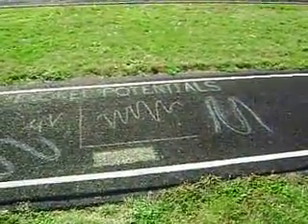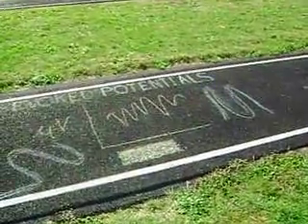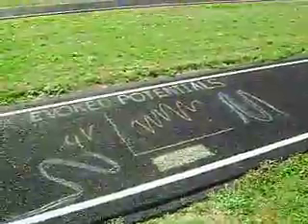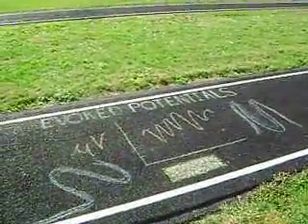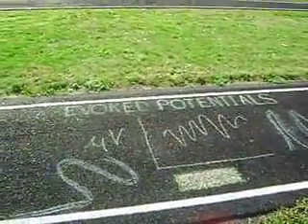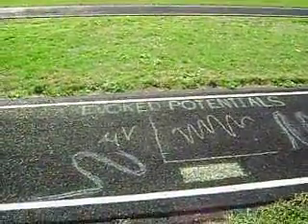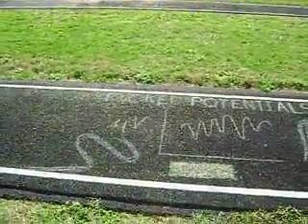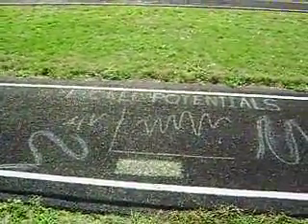Motor evoked potentials, MEP, are derived from stimulating the CNS motor system with magnetically induced or directly applied electrical current. Recordings are made from electrodes placed over muscles. MEPs have yet to gain significant clinical use and will not be discussed further.